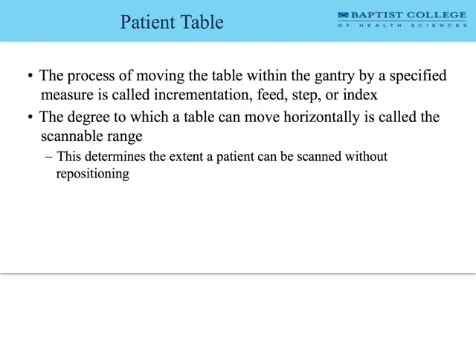We're talking about thousands of photon interactions per second. Thousands of photon interactions per second that it's converting, quantizing to digital information. So when we talk about big data, when we talk about image generation and the sheer volume of images that we're looking at, these things are doing a lot of work.